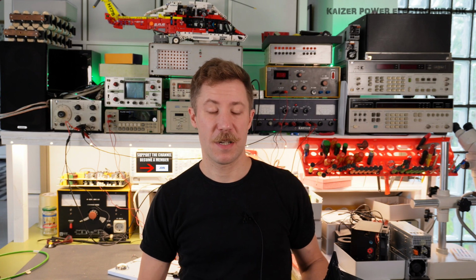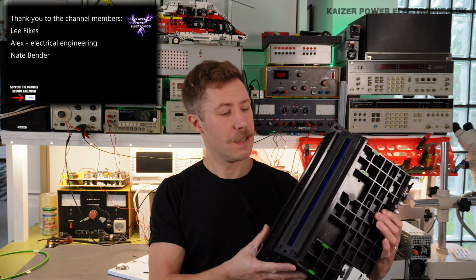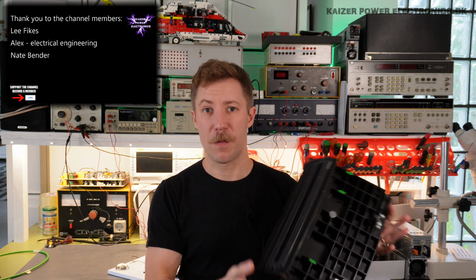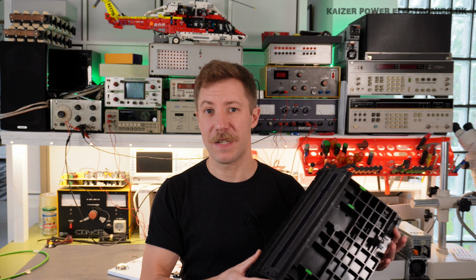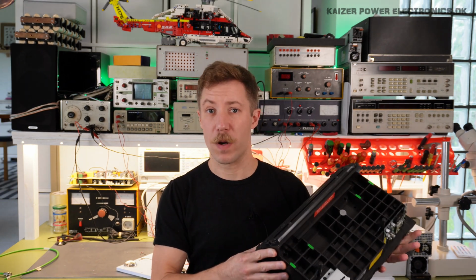This is part two of the Fujifilm PCR Eleva X-ray image scanner teardown, and today we're taking a look at the laser scanning module. Because this is a rather simple unit, we will of course try to do some reverse engineering, get the laser scanner motor to run and turn on the laser diode. So let's take a closer look at the unit and what's inside.